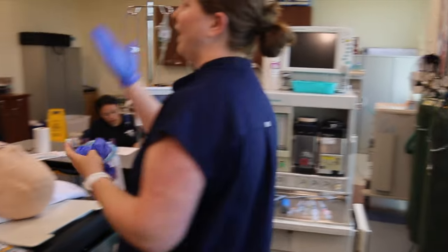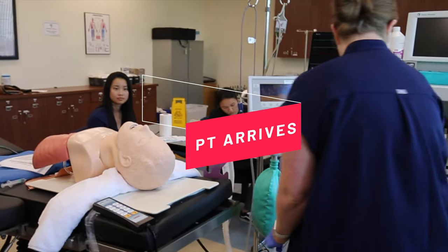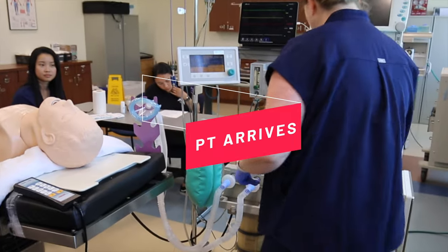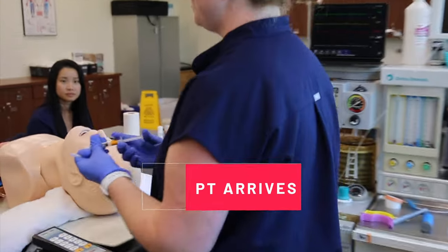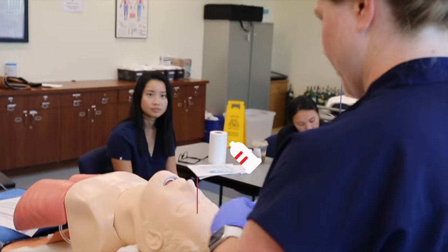So like I said, I saw the patient in pre-op. I've told the circulator that they can go get the patient, so they're on their way back, and here's our patient. All right. Hi, John. Long time no see. He's scooting himself over to the operating table, and I'm giving 2 milligrams of Versed.